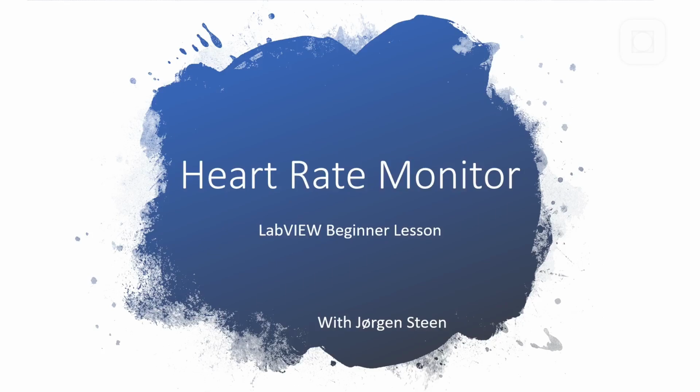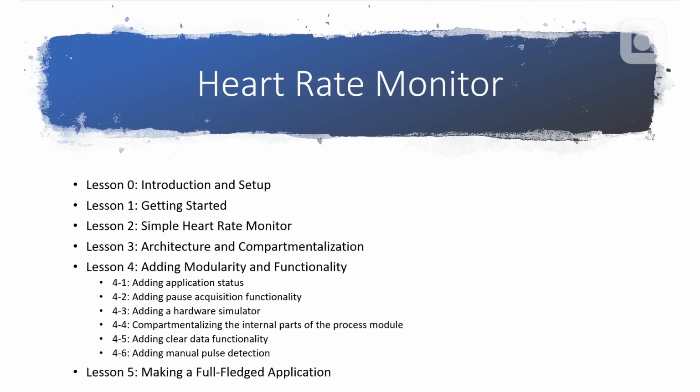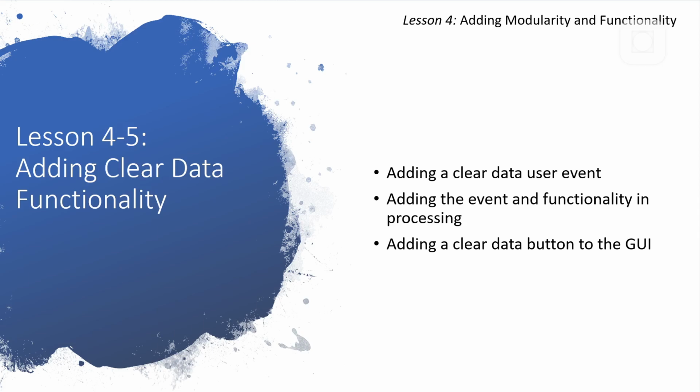This is a LabVIEW Beginner lesson where we make a heart rate monitor. This is lesson 4 where we add modularity and functionality. In lesson 4-5 we'll be adding clear data functionality to the application.